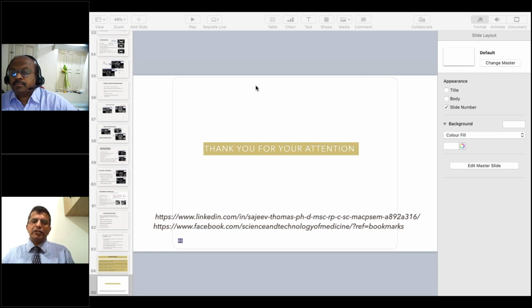And there is specialized QA for special procedures like obsessive compulsive disorders, or if you want to treat trigeminal neuralgia, because in cases like trigeminal neuralgia, we cannot use some of the MPR images, or some of the different T1 or T2 sequences. So we need to define or design specialized imaging protocols without compromising the quality and accuracy. So that is what we do.